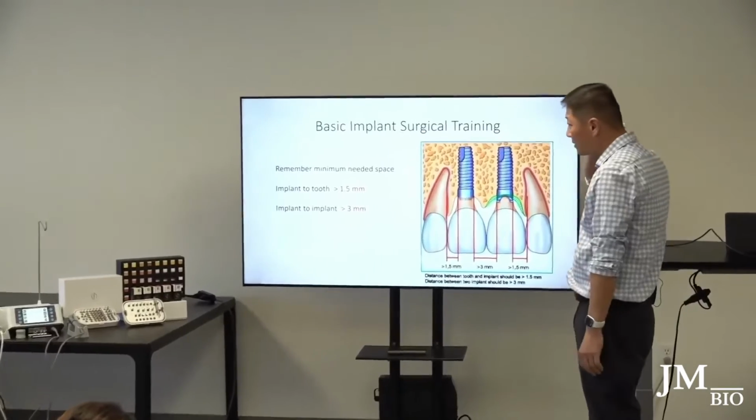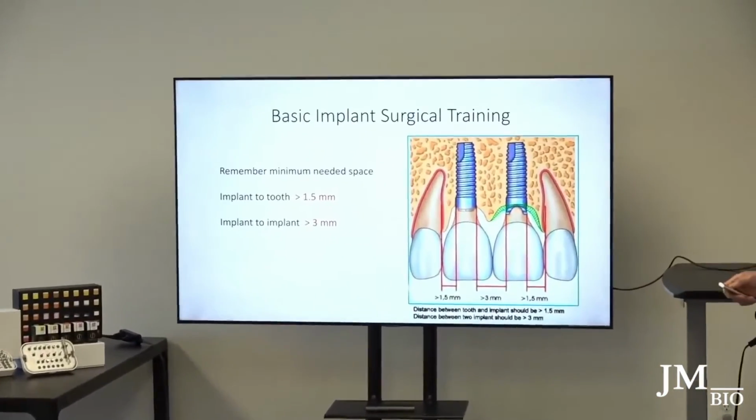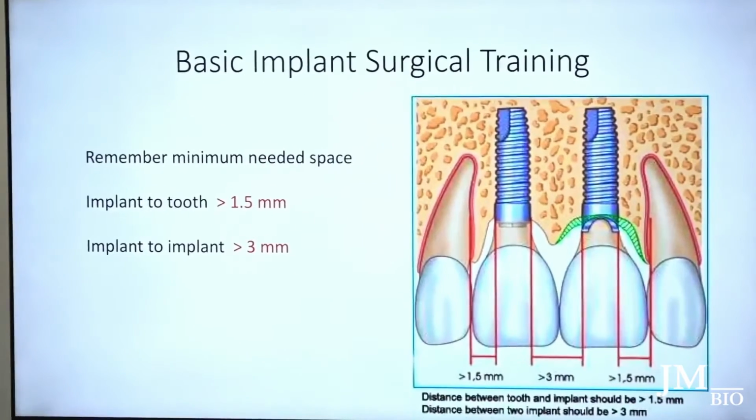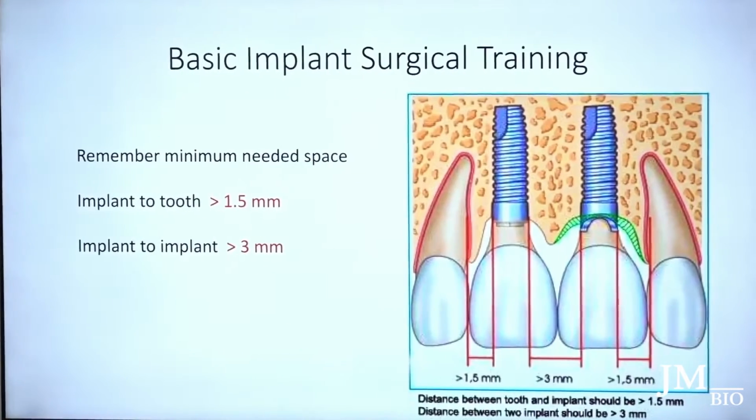And then also the space that you need, the minimum space that you need between the teeth and the implants. You have to make sure that these principles are maintained. You don't ever want to lose these principles.